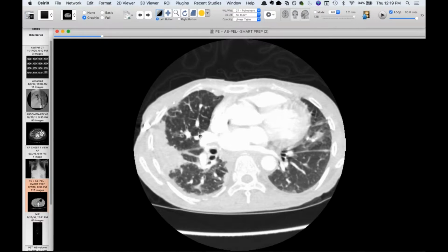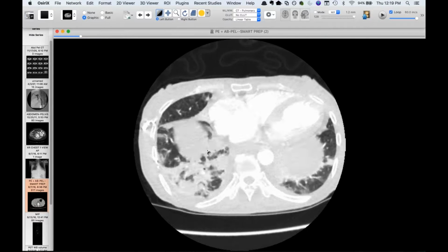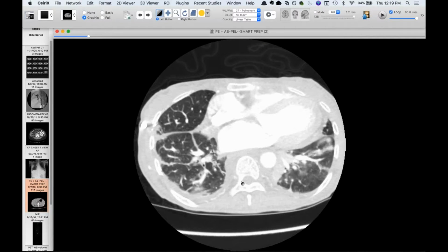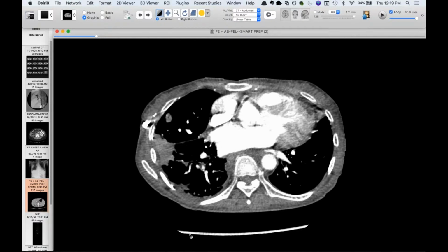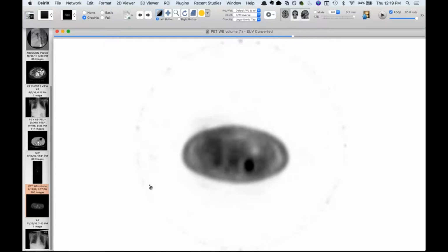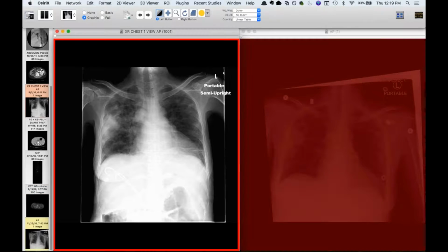And I was a little worried that she had even maybe a little bit of lymphangitis, lymphangitic carcinomatosis. And of course, the history I got at this time was that she had a spindle cell sarcoma or spindle cell tumor. And I didn't really know much else. And you can see even this paravertebral stuff here. She went on for PET a couple days later. And let's see, and not surprisingly, all this stuff is hot. So I thought this was going to be metastatic disease. And I'll just show you, it was not metastatic disease.